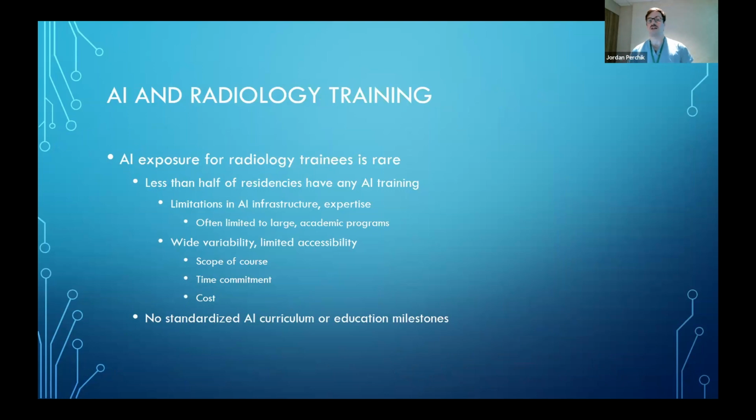So, by us understanding what the algorithm is and how it makes its decisions, we're able to more effectively triage those false positives and convince ourselves that this is not truly an intracranial hemorrhage, and we can let this go. That's important because we don't want to falsely diagnose someone with an intracranial hemorrhage, get them down the wrong treatment path, potentially get them set up for neurosurgical evaluation that wasn't needed, or potentially require an additional inpatient stay that isn't needed. So these things that we have in practice that are supposed to make us better, faster, safer, can sometimes make care worse if we don't know how to use them properly.